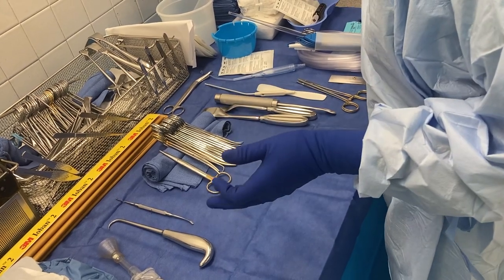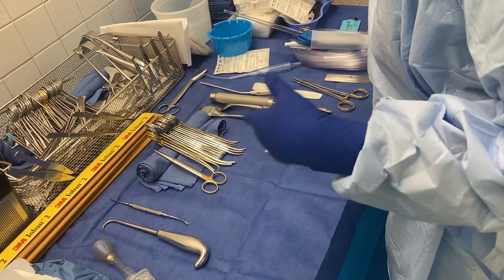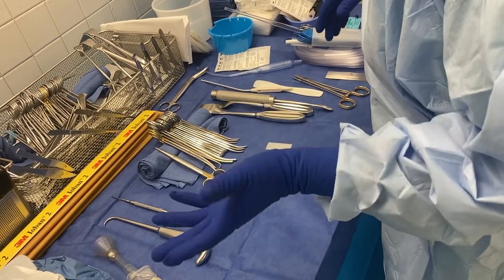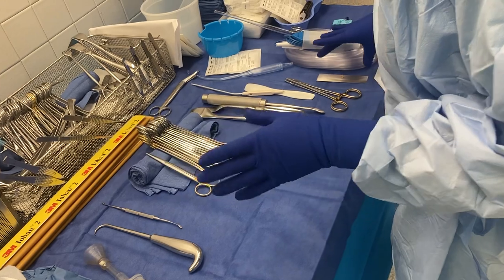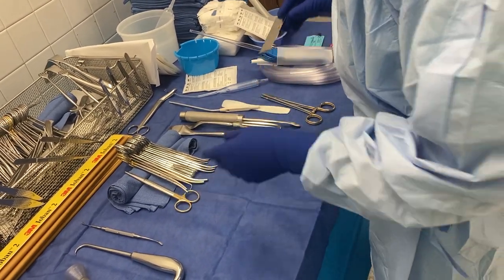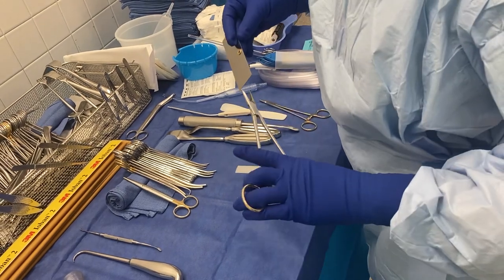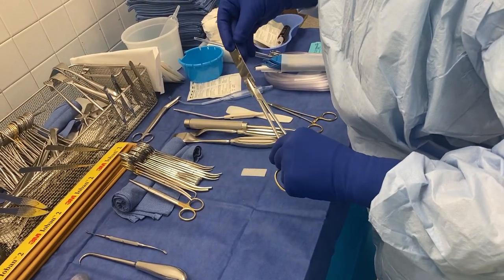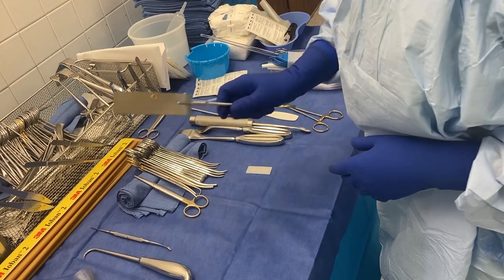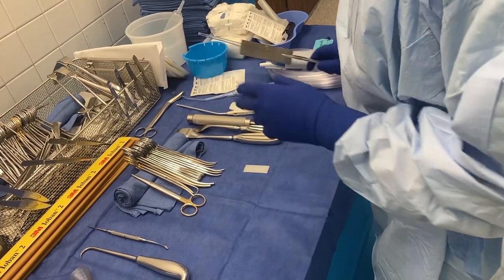We do have an amputation tray, but we don't use it in orthopedics because usually the amputation knife is dull and nobody wants to use it. So we use a dermatome blade, put it on a needle carrier, and basically just guillotine the leg with a dermatome blade.